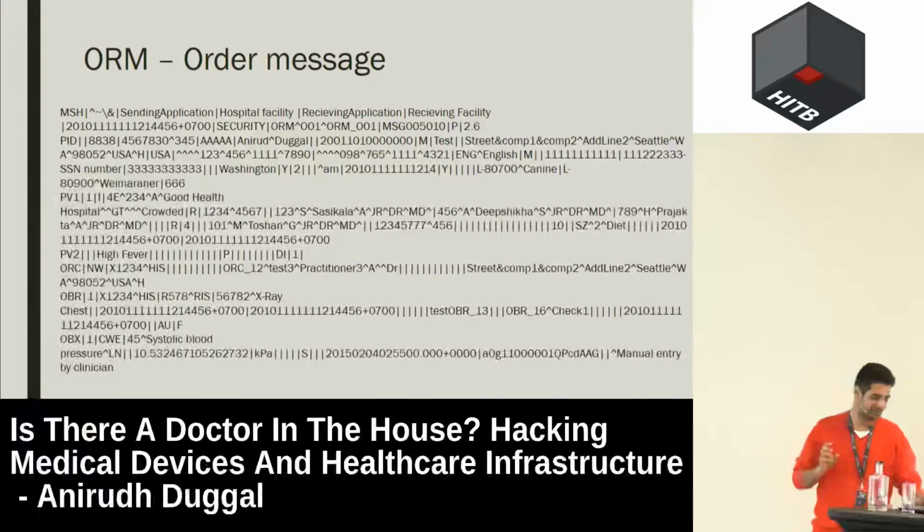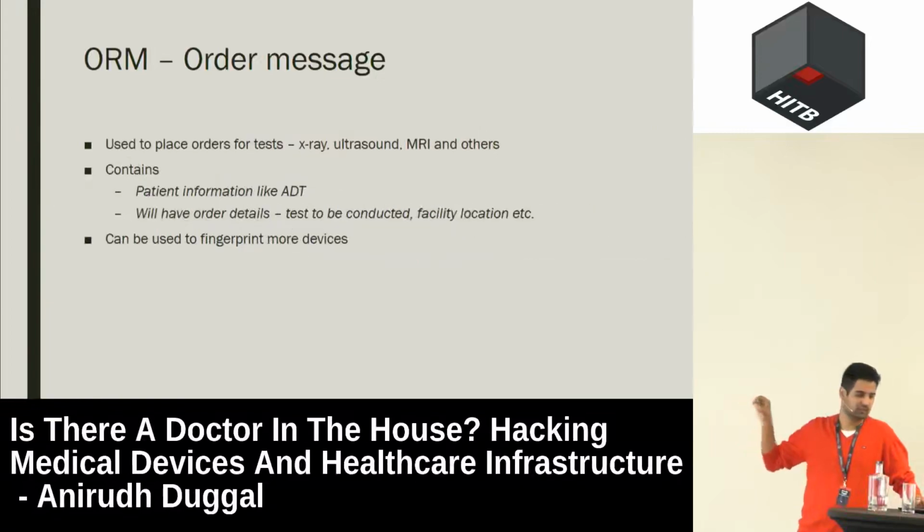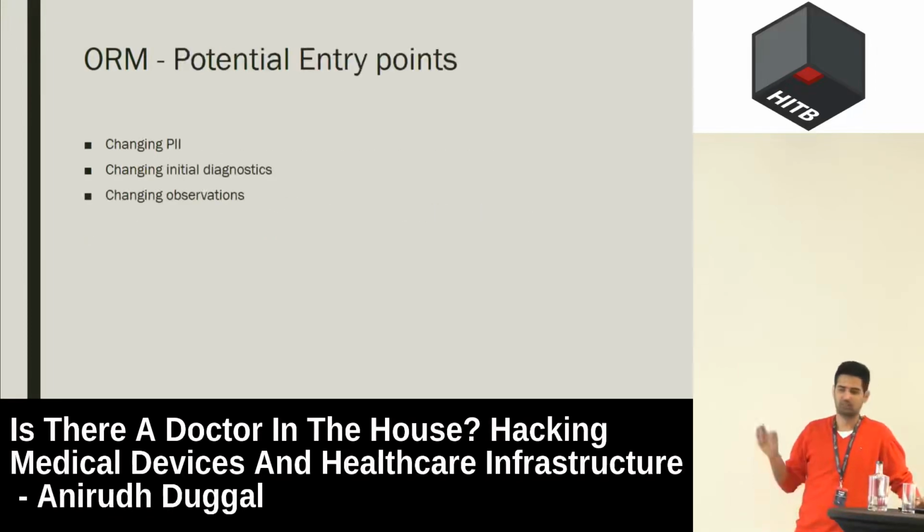No, this is the ORM. Okay, so this is actually the order message. So this is used for targeting other infrastructure. So if your doctor has told you to get an X-ray scan, this guy will actually give that message forward. The next, and it has these X-ray, ultrasound, and it can be used to fingerprint more devices.